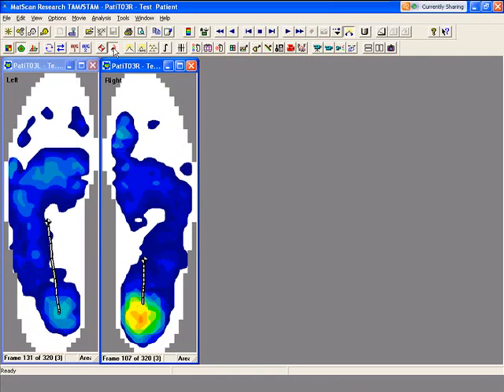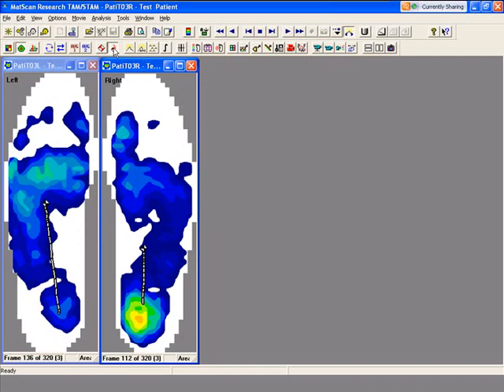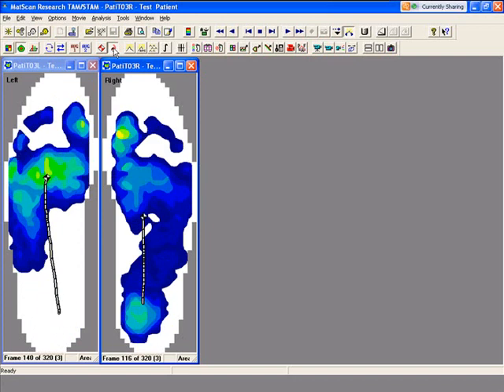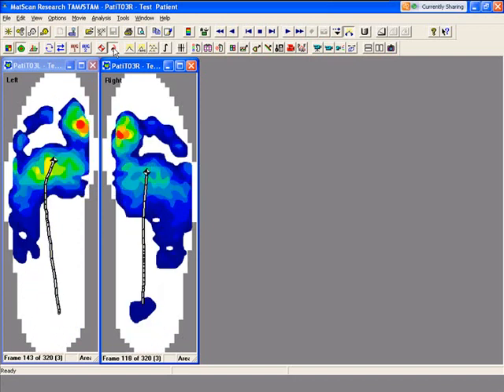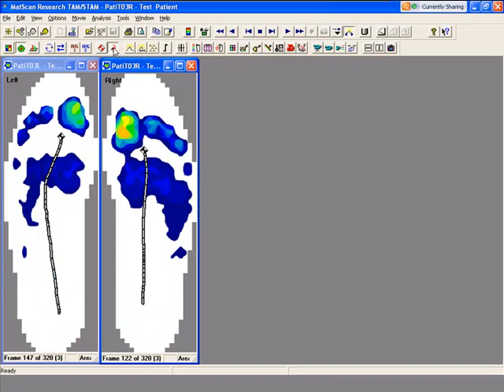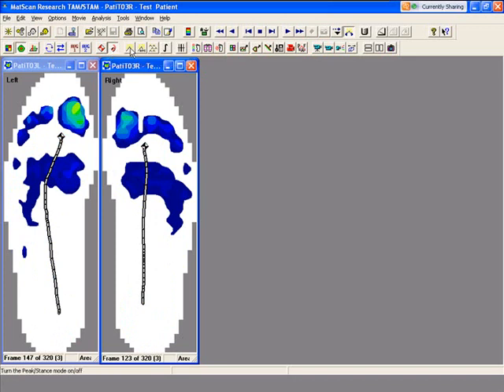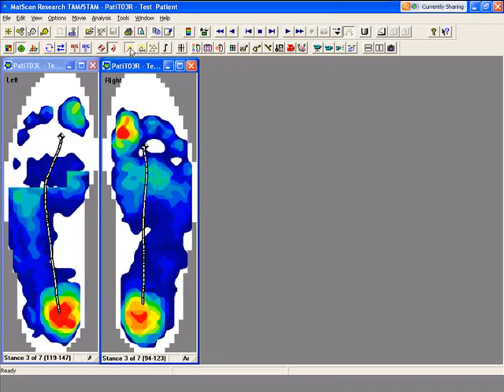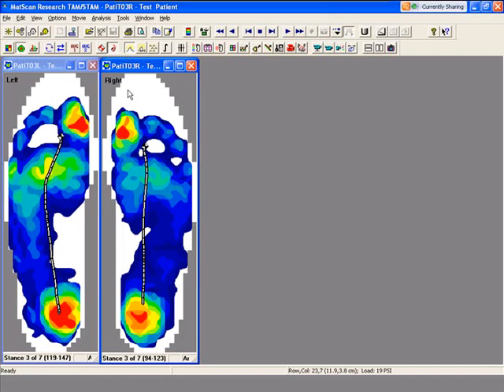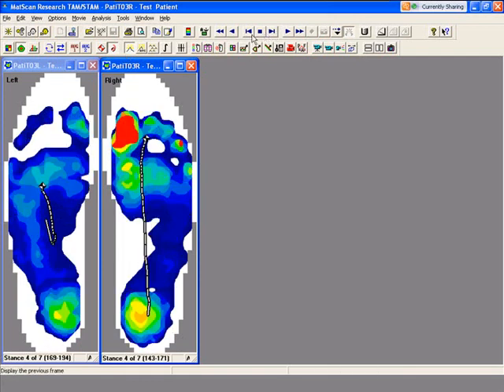You also have the center of force trajectory line where you can see the path that it's taken. On this foot strike, we can look at the path and see if the subject supinates or pronates. You can see the foot on the left goes out to the lateral side and then curves to the medial side, where the foot on the right is more of a straight line. We can also look at this at peak mode to compare each center of force for each foot strike.